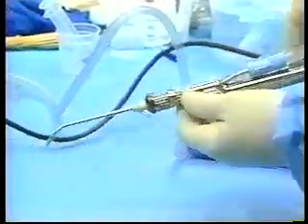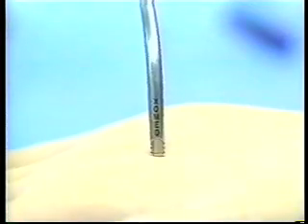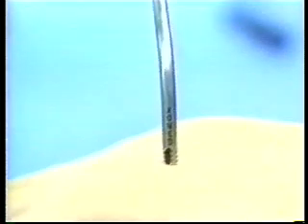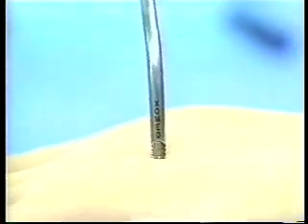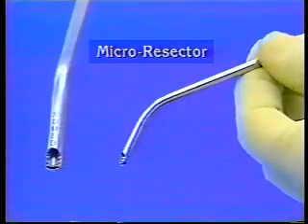The speed is set at 1500 RPMs in the oscillate mode. The window is directed toward the desired tissue, which will be drawn in by the vacuum, and the rotating blade then shaves the tissue. It's important to note that the blade is protected posteriorly and at its distal tip. This allows for rapid, safe removal of the targeted tissue without damage to surrounding structures.